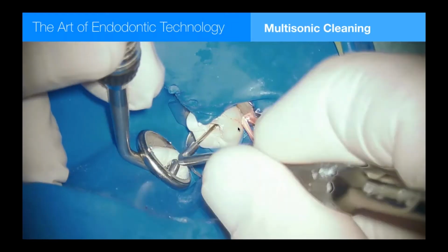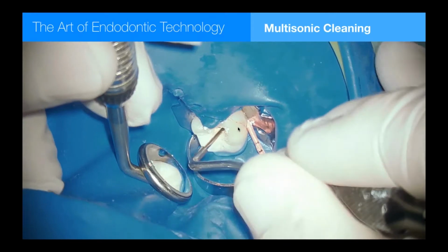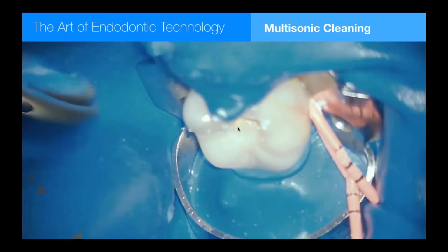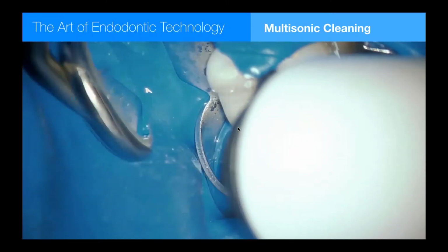I use the Elements Free backfilling syringe. These are both cordless. They are the only cordless down pack and backfill units I've used that operate the same level, the same speed of heating as the fully wired corded units. Here are the 2 canals. The needle goes in place.